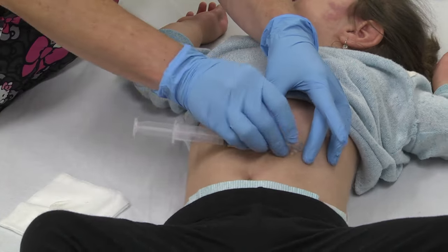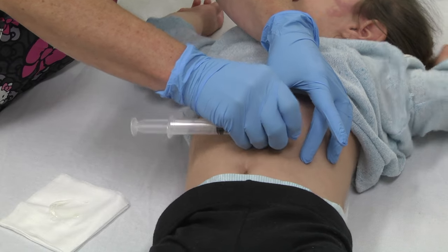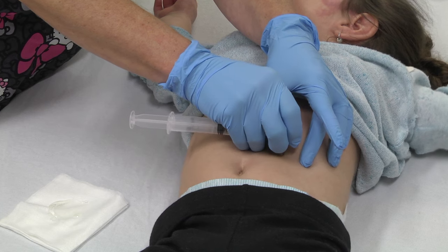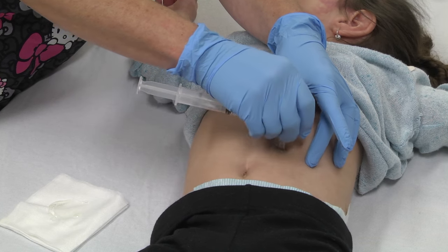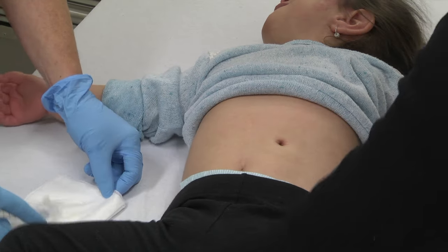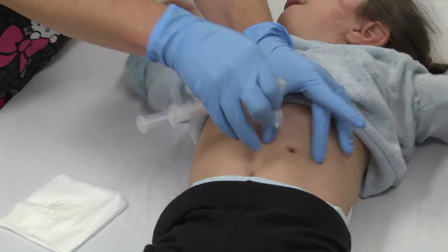Attach a 10 mil slip tip syringe into the balloon port and gently pull back on the syringe plunger to remove the water from the Mickey button. Remove the Mickey button by pulling up gently and rotating the G-tube.